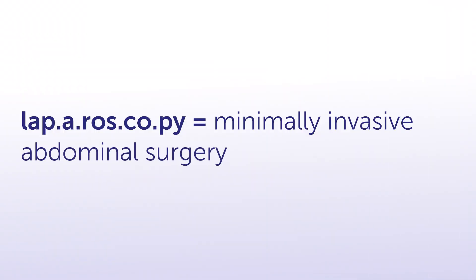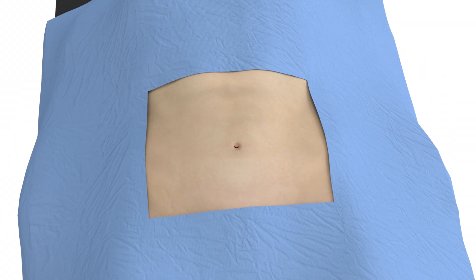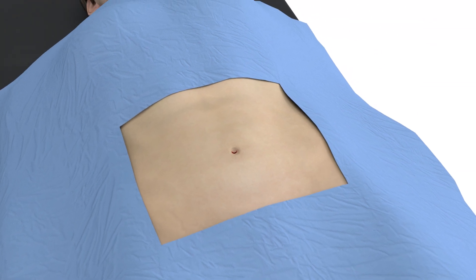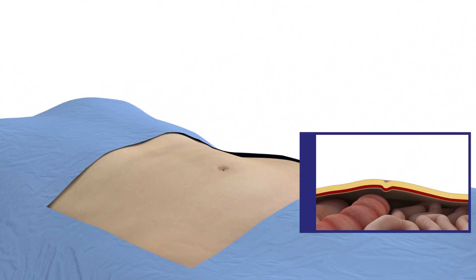Laparoscopy is a minimally invasive surgery of the abdomen, using several small incisions instead of a single large one. Thin cameras and surgical instruments are passed through these incisions, allowing the surgeon to perform the procedure inside the abdomen while visualizing it on operating room monitors.